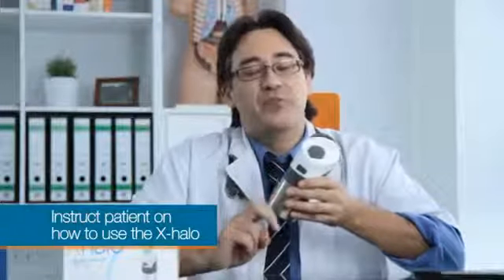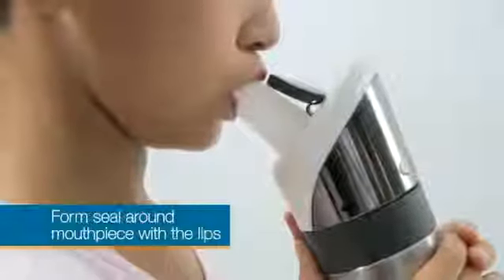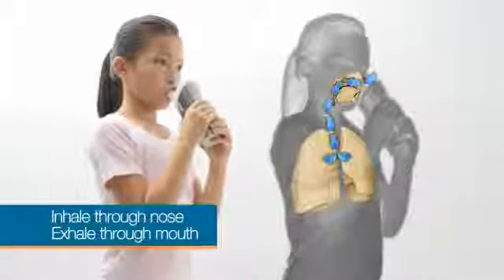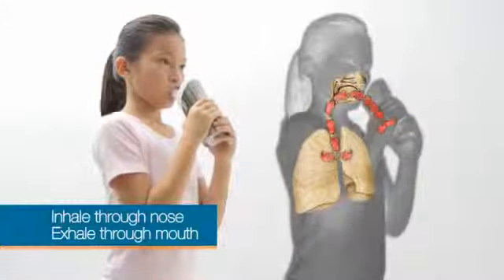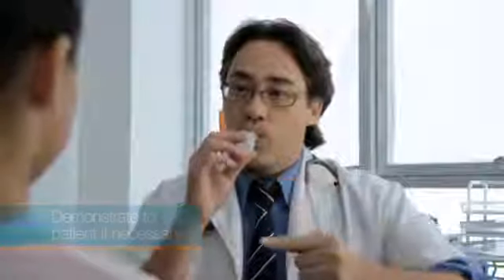Before we take the reading, it's important to instruct the patient to use the device correctly. Emphasize two points: first, the patient needs to form a seal around the mouthpiece with the lips so that the air is completely channeled into the device during exhalation. Secondly, the patient needs to inhale through the nose and exhale through the mouth into the device, like blowing a balloon. It might be advisable for the doctor to demonstrate the technique with a separate mouthpiece. The patient can then be asked to practice, and you can coach the patient as you observe.